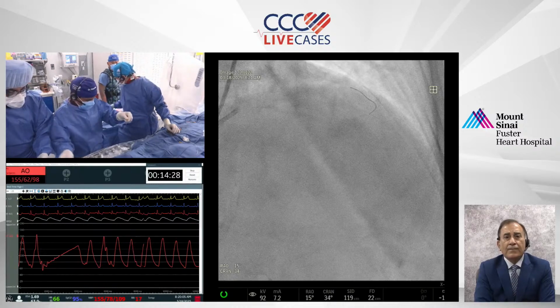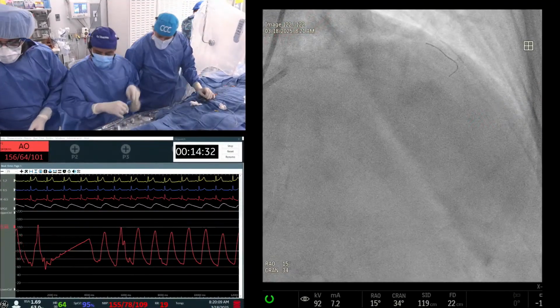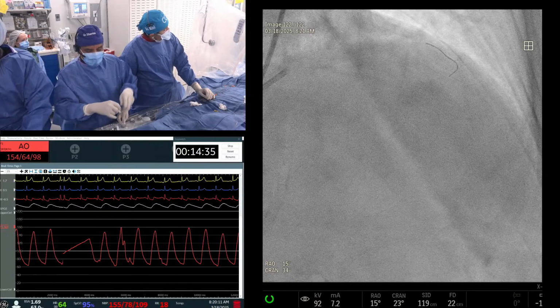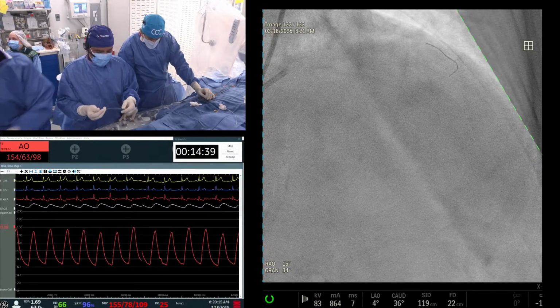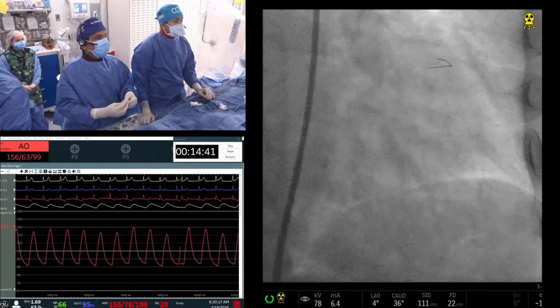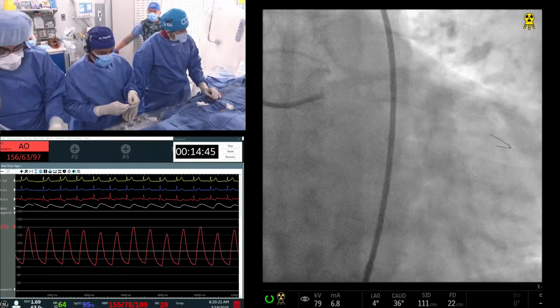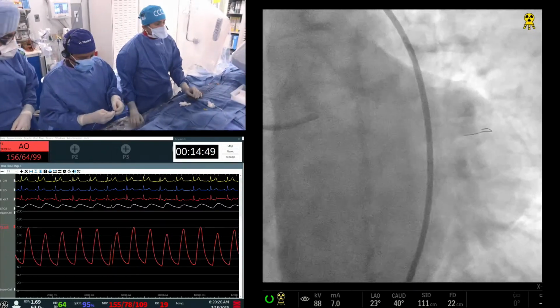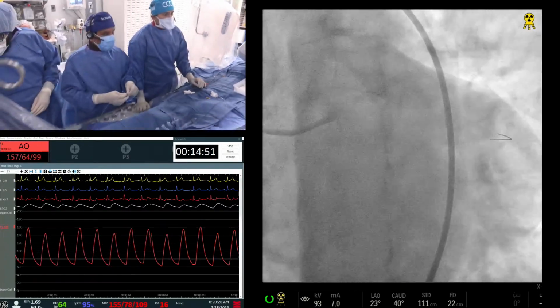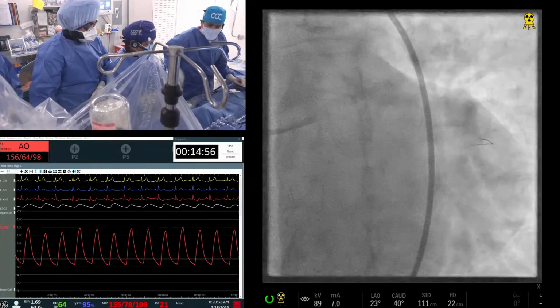Same points: of course, expertise is there, but basically don't leave the wire in your burr and then try to move the wire; it is impossible. So you take it out, that's what we did, and now we are ready for the same 1.5 burr. And I can tell you these speed numbers of 160, 180, 200 came from David Auth's bone experiment in his garage. Can you take a picture?